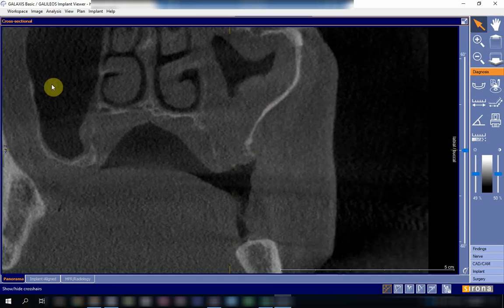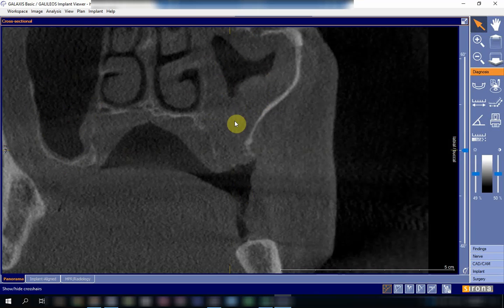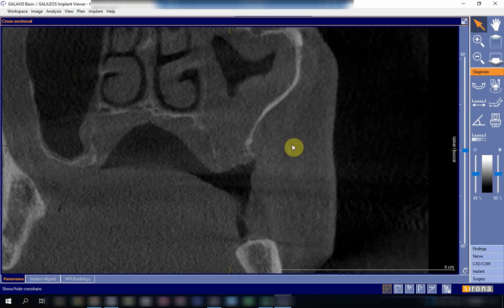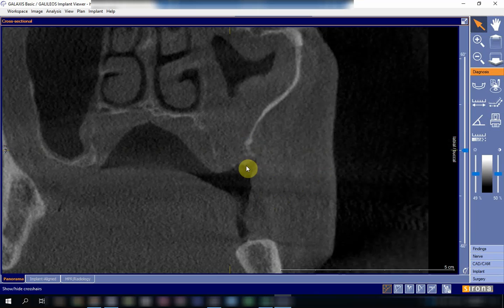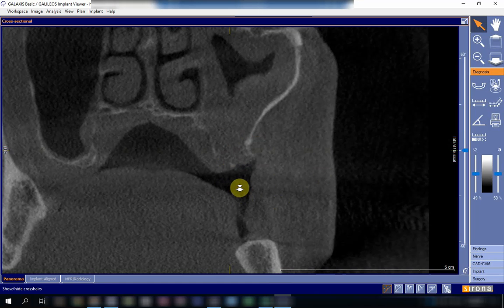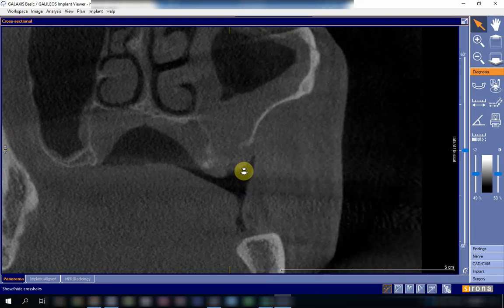Comparing the left sinus to the right sinus, you can see the left sinus is clear with no granulation or thickening of the mucous membrane. The right side, by contrast, shows a small patent area while the rest is thickened mucous membrane due to what could be chronic sinusitis in reaction to irritants coming from the oral cavity.